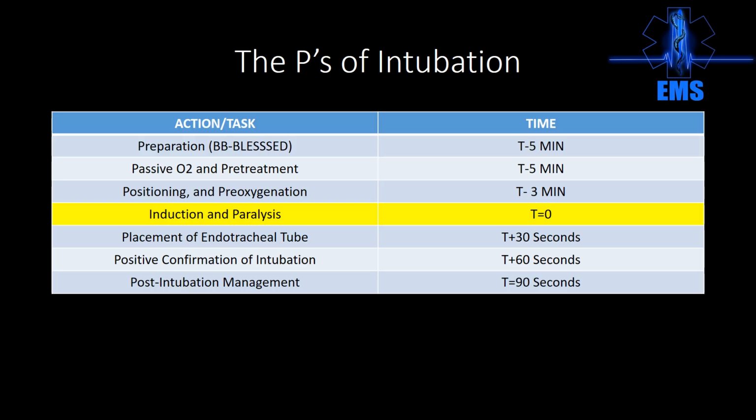So we can certainly induce barotrauma, but more importantly, remember that McDonald's that was sitting in the stomach? If you blow a liter into somebody, that McDonald's will come up. Bagging faster and bagging harder does not make the oxygen saturation come up any faster. So there's no reason, again, to fill this patient up.